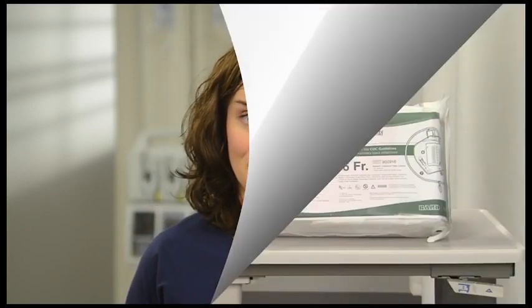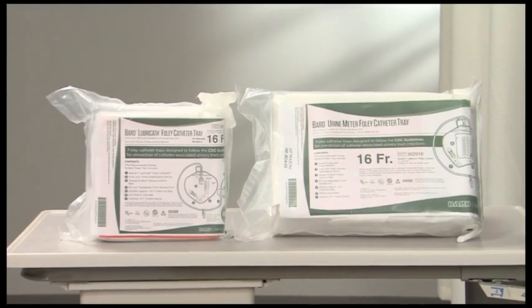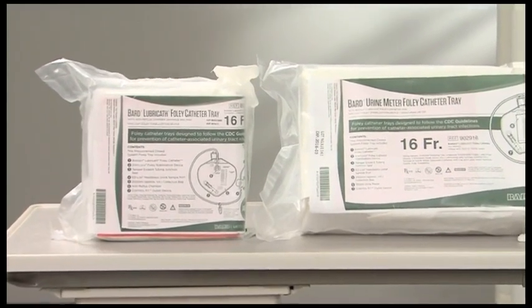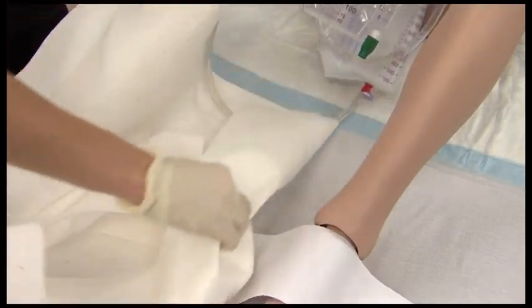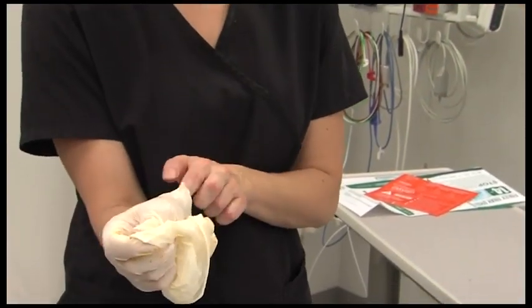bladder neck. If successful catheter insertion is not completed, including breaks in aseptic technique, replace the catheter and collecting system using aseptic technique and sterile equipment. If proper catheterization is not accomplished, use a new catheter system. After inserting the catheter, discard all materials in accordance with hospital policy and remove contaminated gloves.